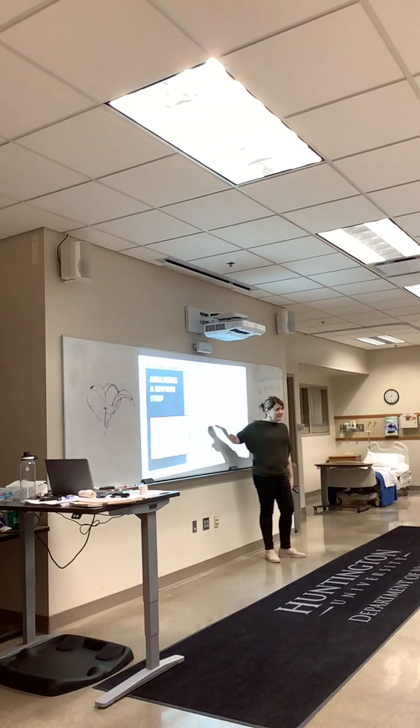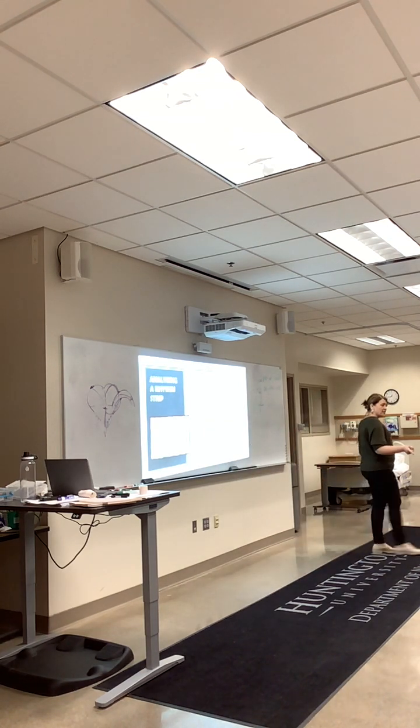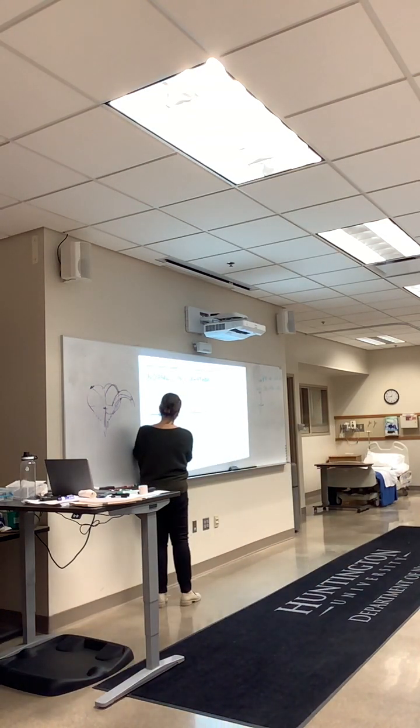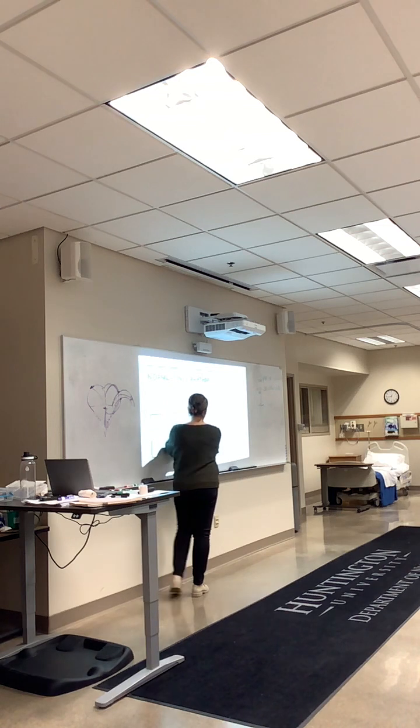I'm going to look at my rate. Is it 50? Is it 180? Is it 20? What's my rate doing? And then I want to know if it's regular or irregular. Regular means, let me throw up this one here. This is a regular rhythm, your normal sinus rhythm. If I measure here, this should always be the same distance.